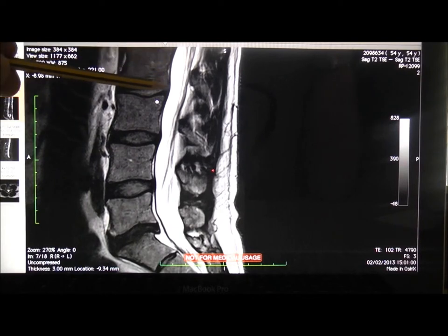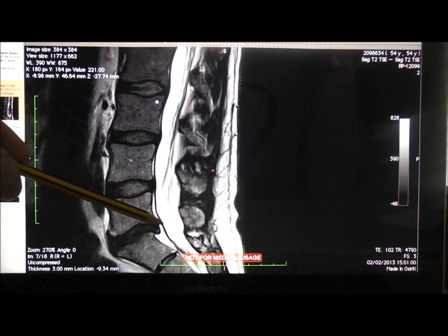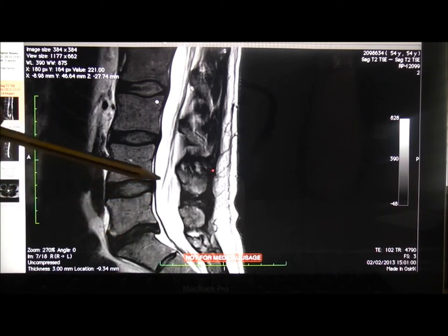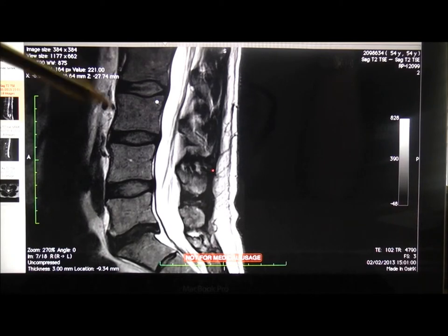At the back of the spine we've got the posterior longitudinal ligament, and you can see here at the bottom it's starting to peel away and pull away. The reason for that is there's some disc damage down here that's been bulging and buckling into this ligament and pushing it away. At first sight the obvious diagnosis is disc degeneration — this chap has got a little bit of a tear at the back of the disc.